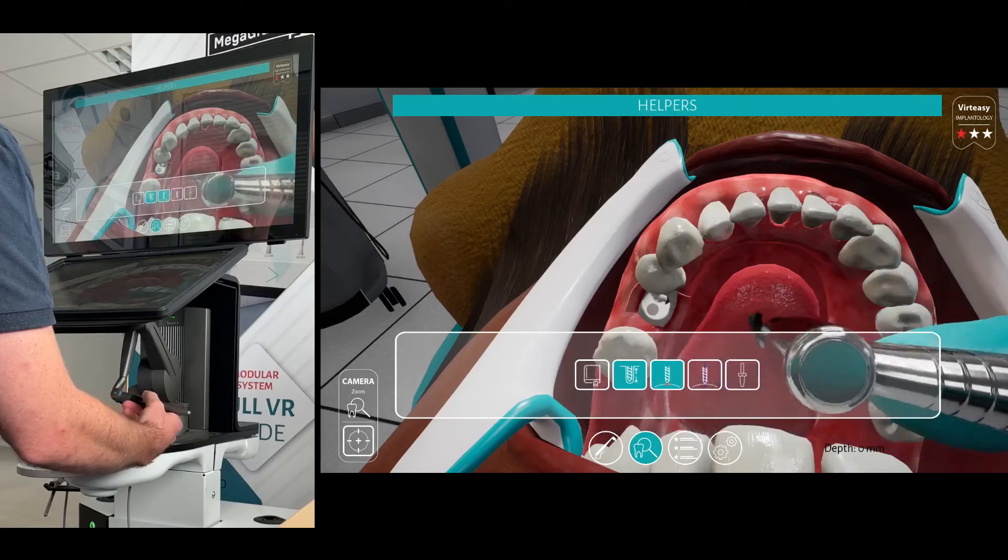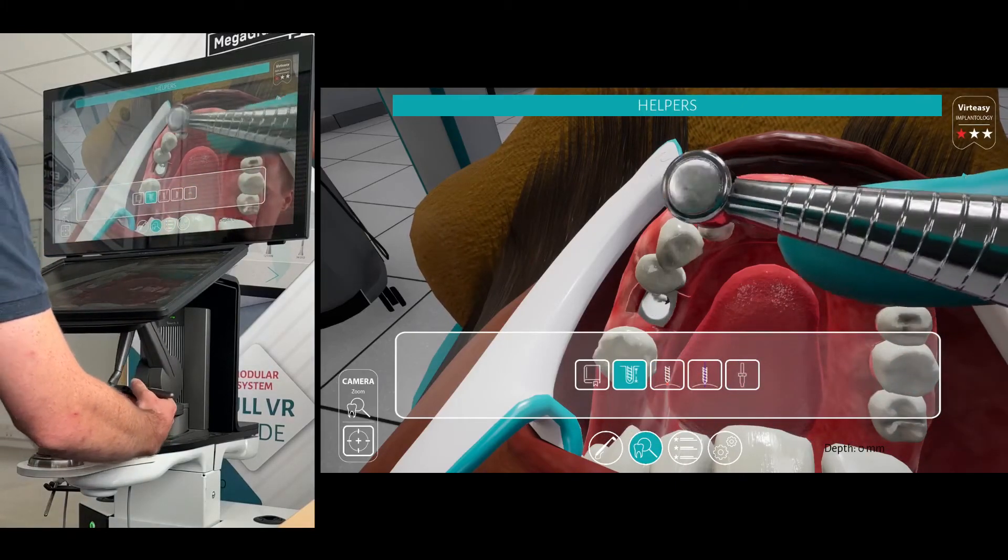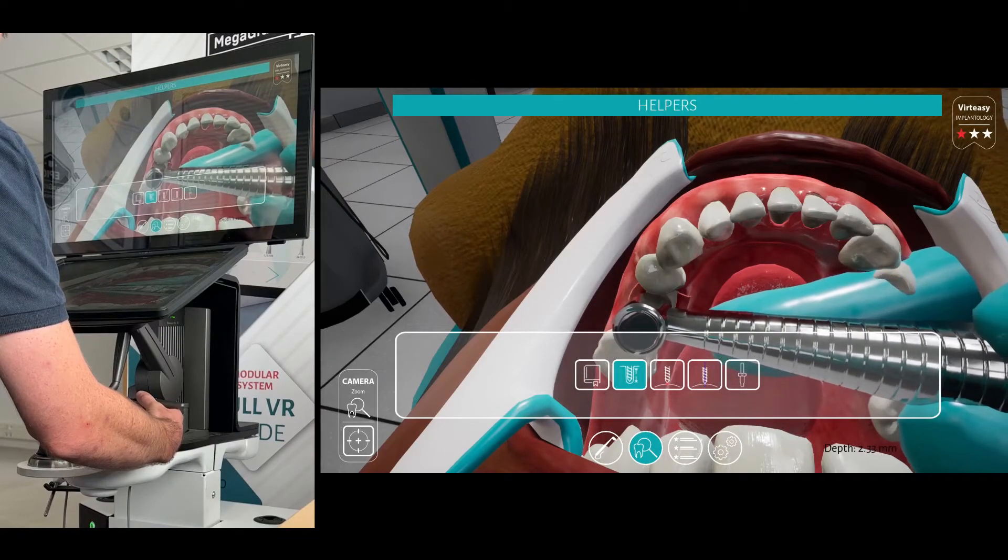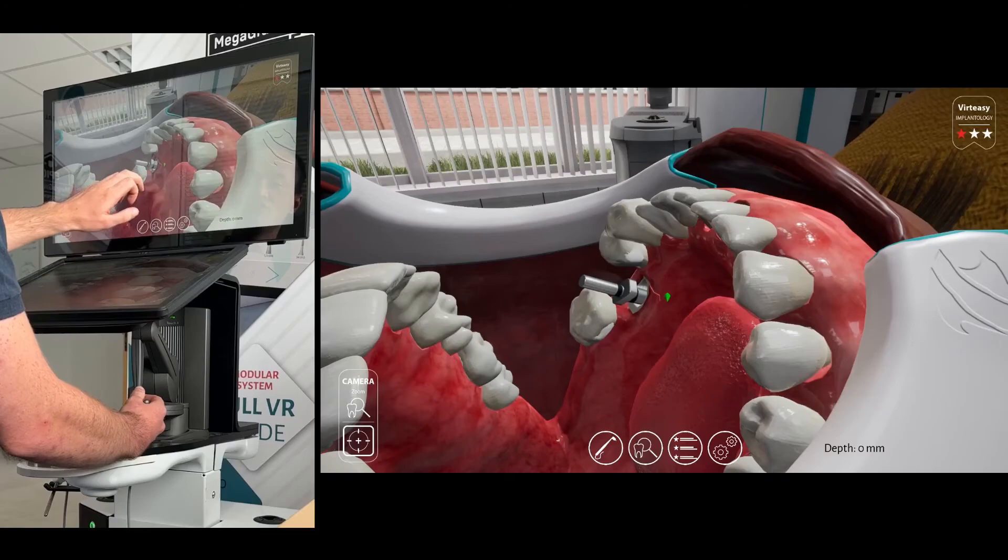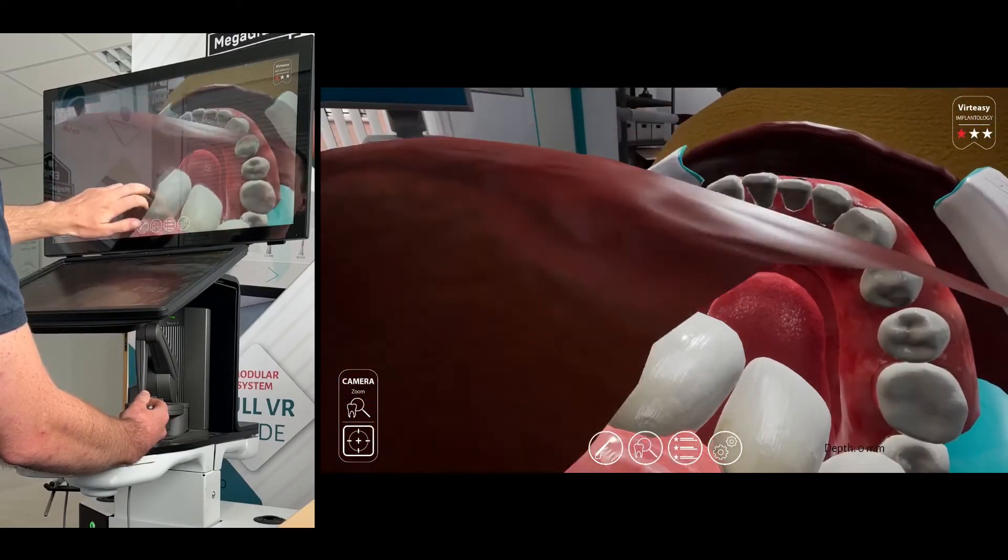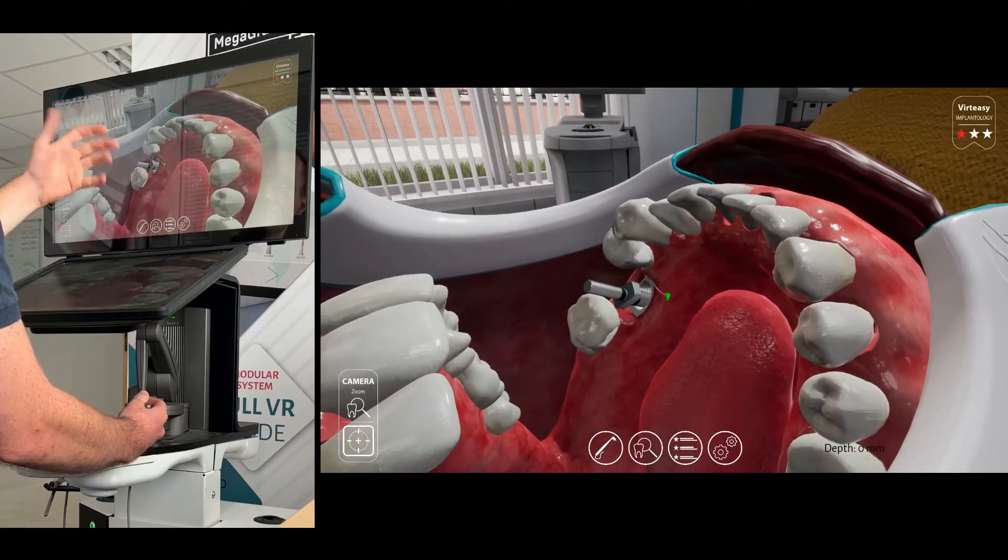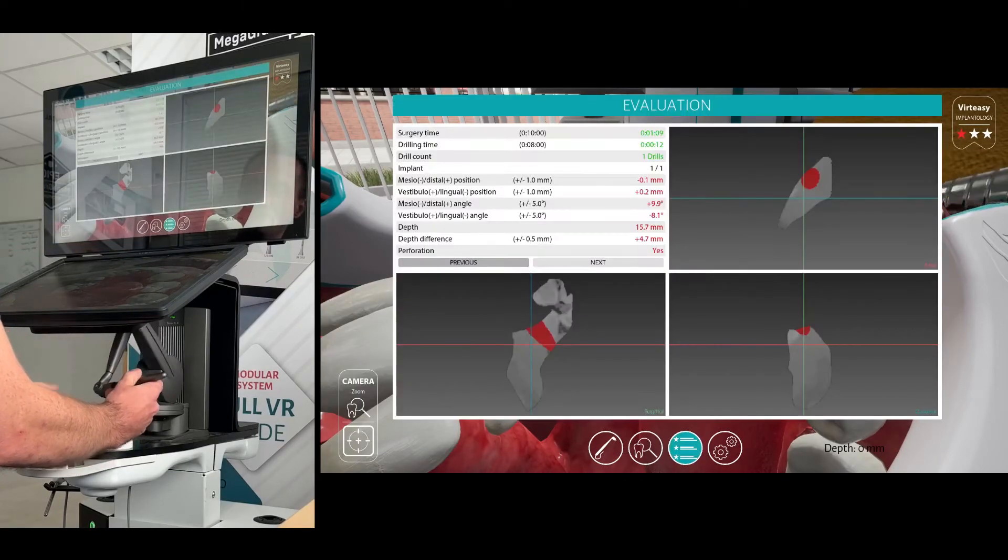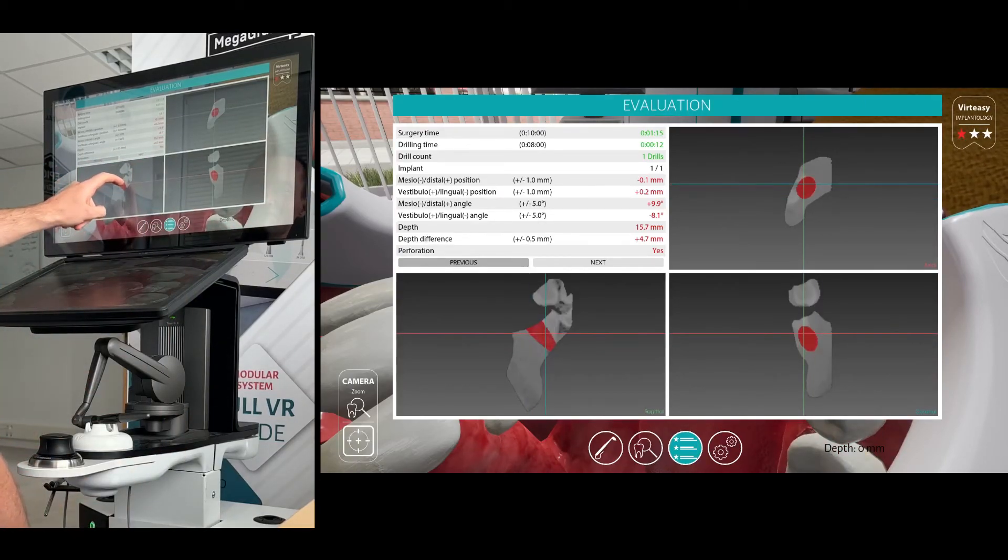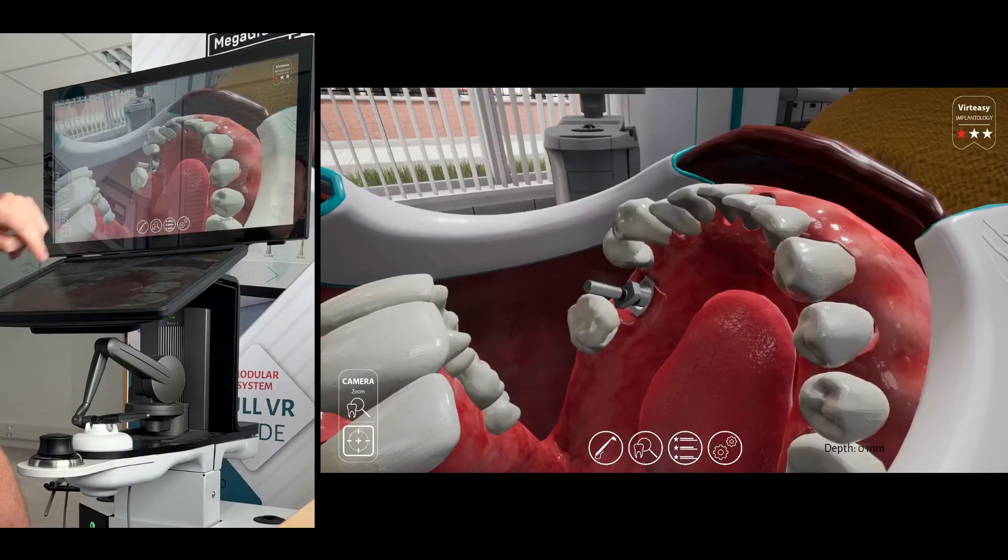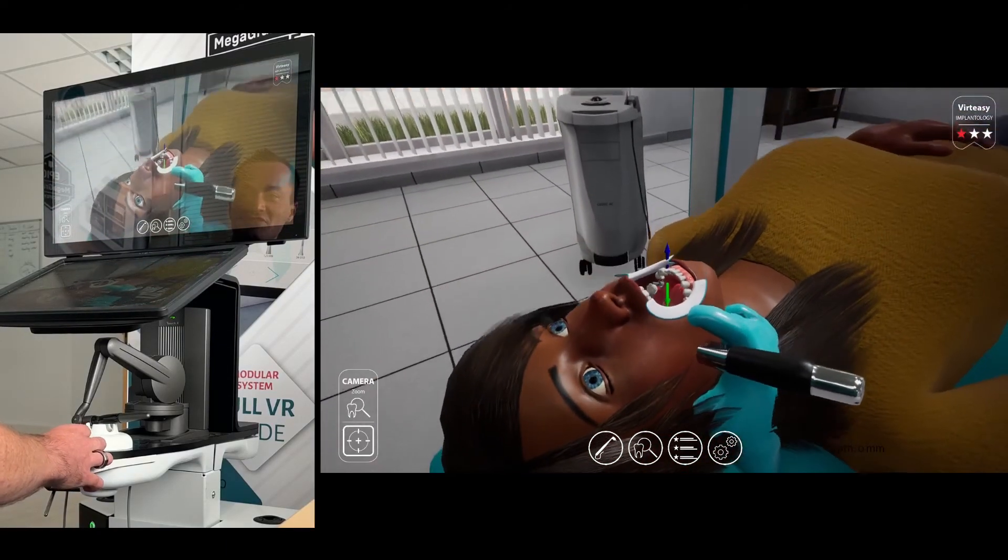And let me just go even deeper to make sure this gauge comes up. There we go. So we've got a visual gauge once that hole is smooth enough, once it's wide enough. And that helps you see the placement of it to see whether or not we've done well enough. Now of course you also have the evaluation in that third window. So you'll see I've done a horrible job here. I've had a perforation and my depth is far too big as well. But that shows you the overall purpose of the planning and how to do one on the simulator.